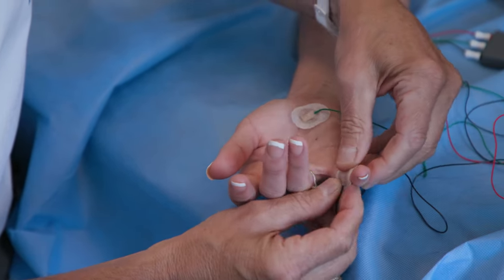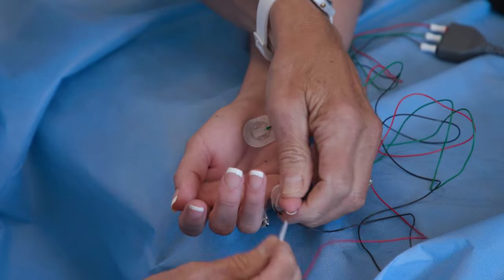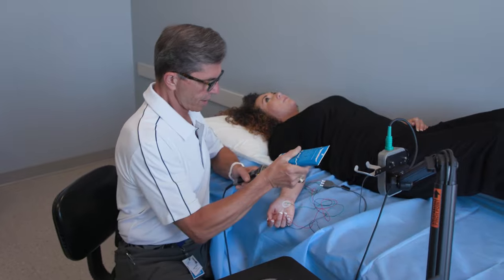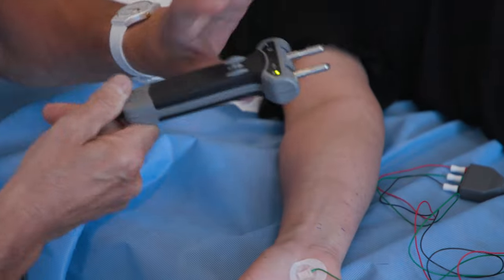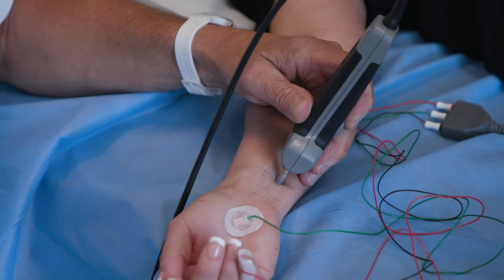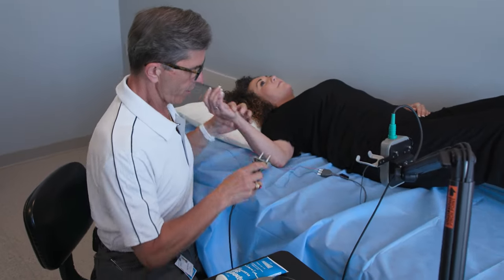Just relax your hand now, we're all set. You don't have to give me any feedback except obviously if it's uncomfortable. So we're going to start off with a little impulse in your pinky finger and your ring finger. As I mentioned, you won't feel anything at first. I've given you the first shock. A little stronger — I'm sure you felt that one. And this is probably the last one.